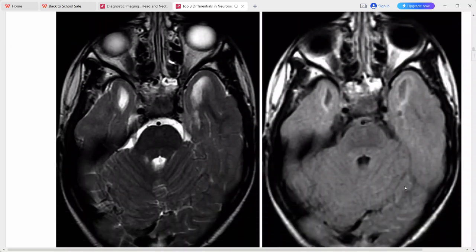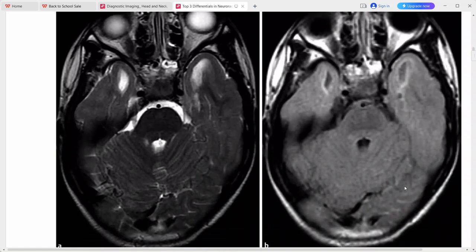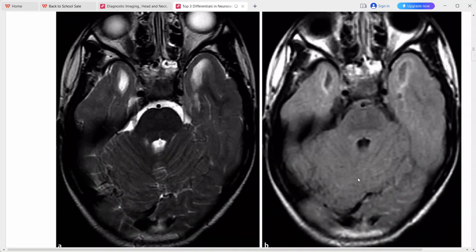This is a young girl presenting with developmental delay. Axial T2 and FLAIR sequences show bilateral subcortical cysts within the anterior temporal lobes with surrounding gliosis. Considering this imaging picture of subcortical cysts in a child, the top differential is megalencephalic leukoencephalopathy with subcortical cysts. CMV infection or CADASIL can also be considered.